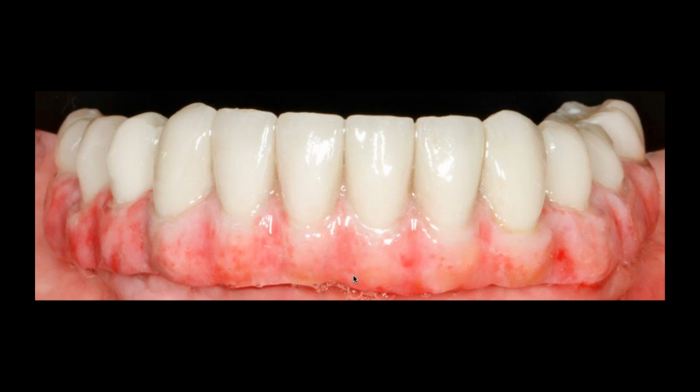So I think with this, I would like to close today saying that implant position is crucial for the long-term success of any type of restorative material. If I want to go with monolithic implant solutions, you can use Enamic for full contour restorations. If you're going to go for cement retained solutions and you need to create a custom abutment, always use zirconia, because that will give you more room for a better design, more concave design at that critical contour area, and Enamic can be used as well for full arch implant cases like this one.